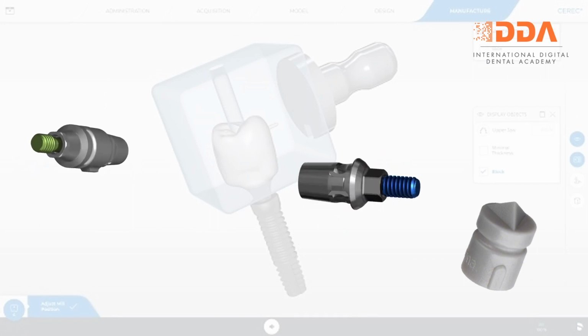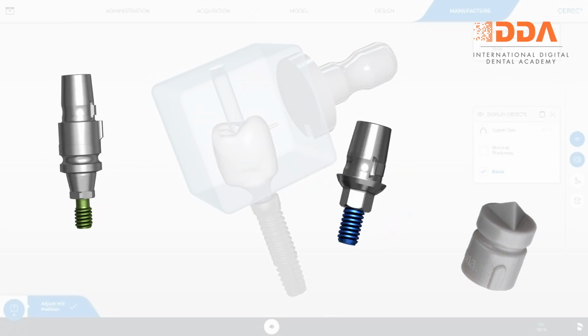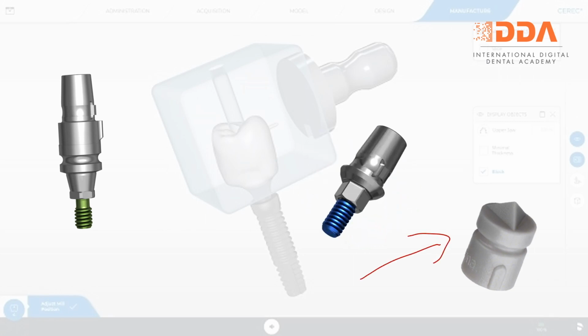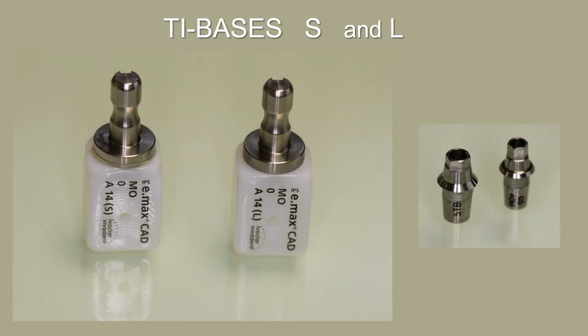So when scanning implants, we can use a scan post or a Ti-Base to scan the actual implant. Both of these will require the use of the scan body. Ti-Bases come in two sizes, a small and a large. Ti-Bases are our definitive titanium abutments which are used to connect the implant to the milled restoration. We have the option of both small and large pre-manufactured blocks with the correct sizes for the corresponding Ti-Bases.